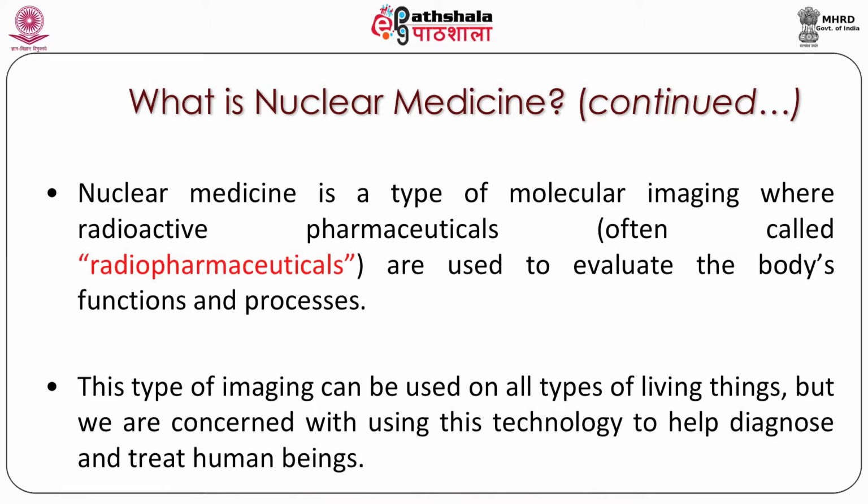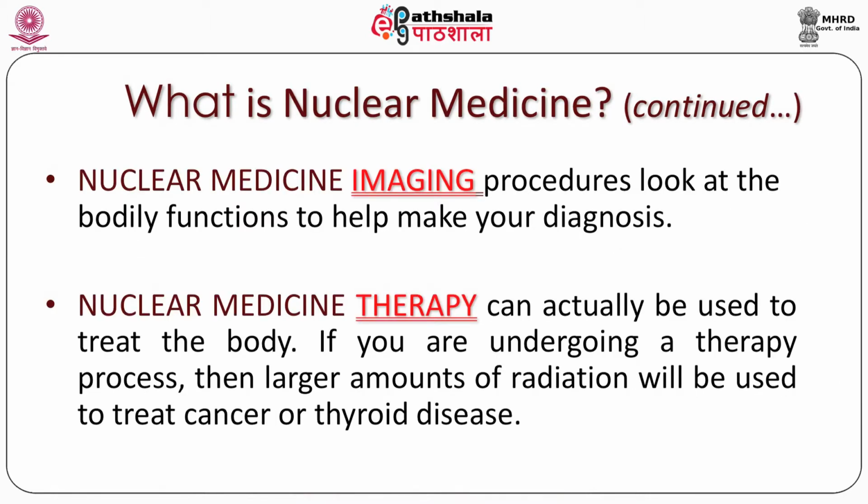It means nuclear medicine is not only for diagnosis, but is well used for treatment purposes also. What we are emphasizing is that nuclear medicine is the only modality available in our country which can be used for imaging as well as for therapy. X-rays, CT scans, MRI give a good anatomical picture, the structure, and by this we can diagnose disease. But apart from that, for getting the function of the body and the organs, nuclear medicine plays a very, very important role. It can be used for therapy purposes also.